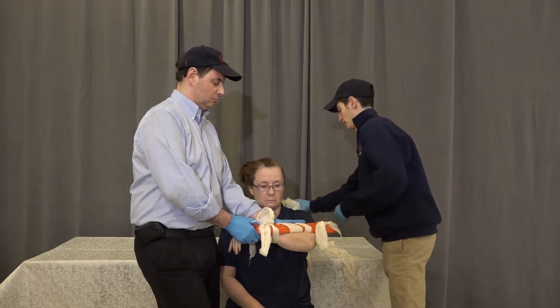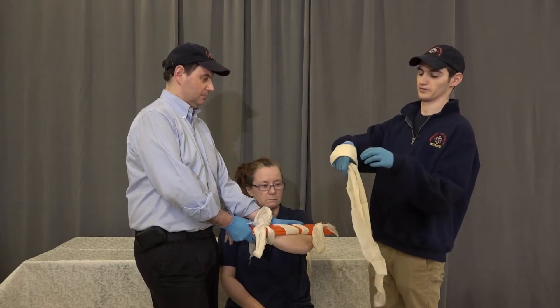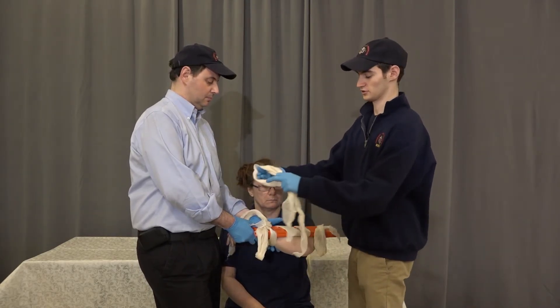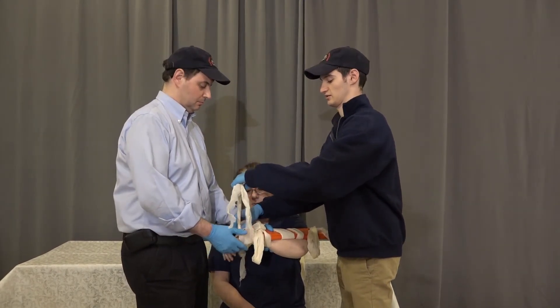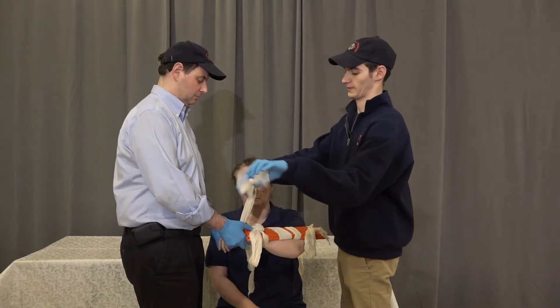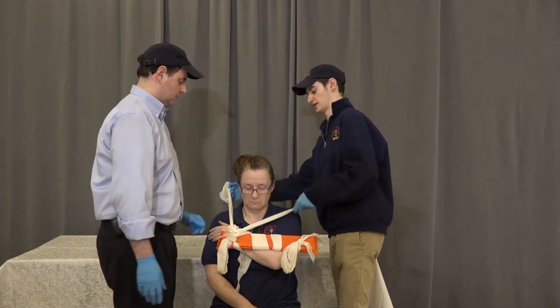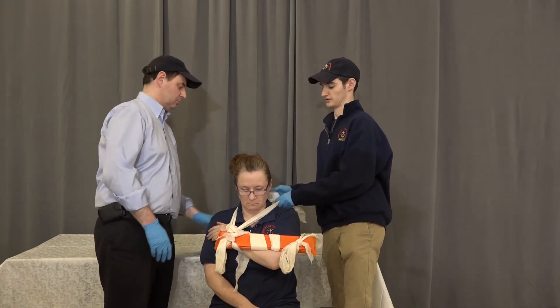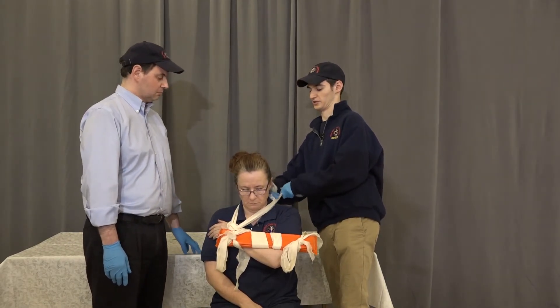We're now going to create a wrist sling or a cuff sling for the patient. We're going to place the patient's hand through the hole in the sling, split it apart bringing it close up onto the body, and tie it using the padding from the 4x4 at the back of the neck, a little bit off to the side.